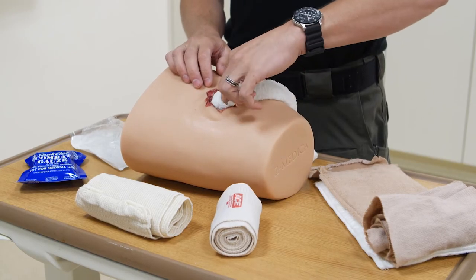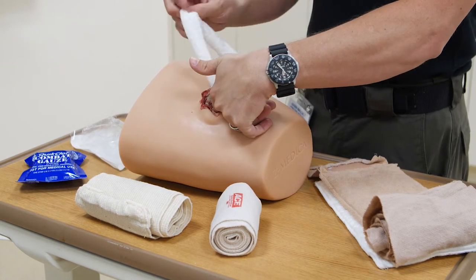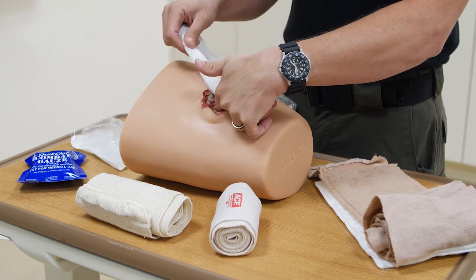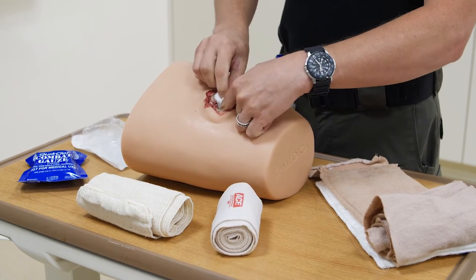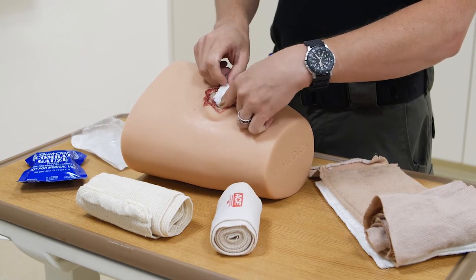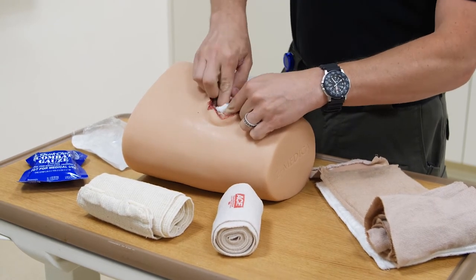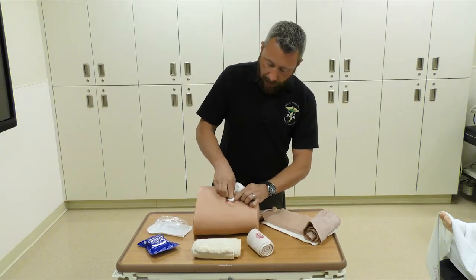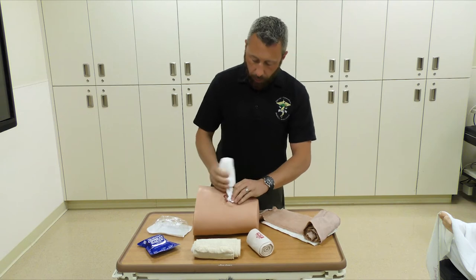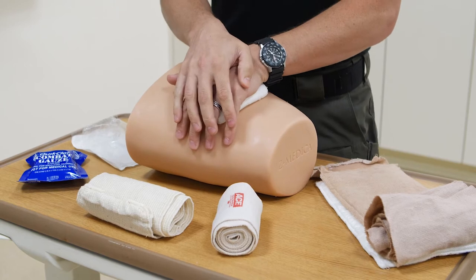By taking that non-dominant finger, you're going to push it down as deep as you can toward where the artery is. The second hand is going to take the actual gauze and start to push it down and in. Maintain pressure with your non-dominant hand — the first one that went in — and keep feeding the product in, whatever you have. Keep doing that until you have no more room to pack, then place the rest on top and hold pressure.